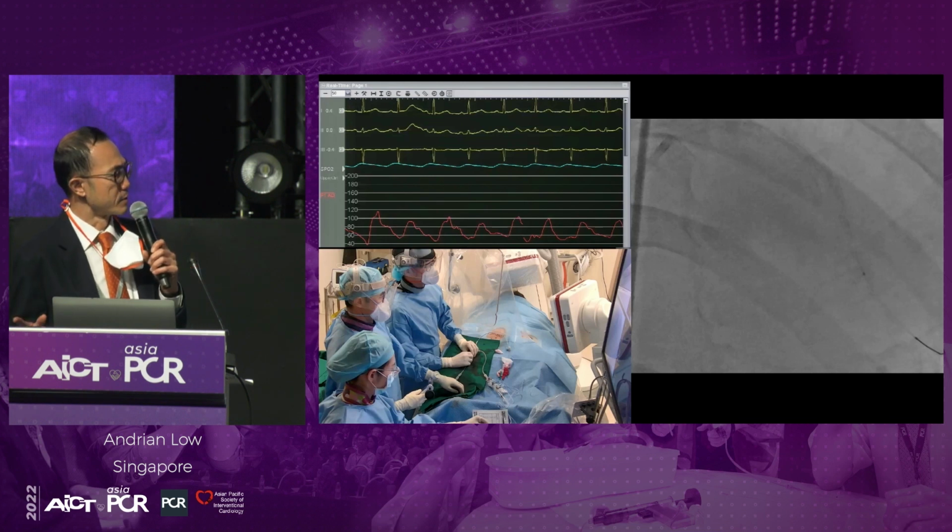So maybe I could just pause here to ask the panel, would any one of you consider treating also a distal LAD lesion, or would you just leave it alone? Fauzi, what do you think? Yeah, I think we have to treat the distal lesions here. But whether it should be stent or stentless, it is another issue. Yeah, good point. What about you, Virash? Would you stent? Also agree that it's difficult to select a stent. Maybe I will treat with a drug balloon if possible.